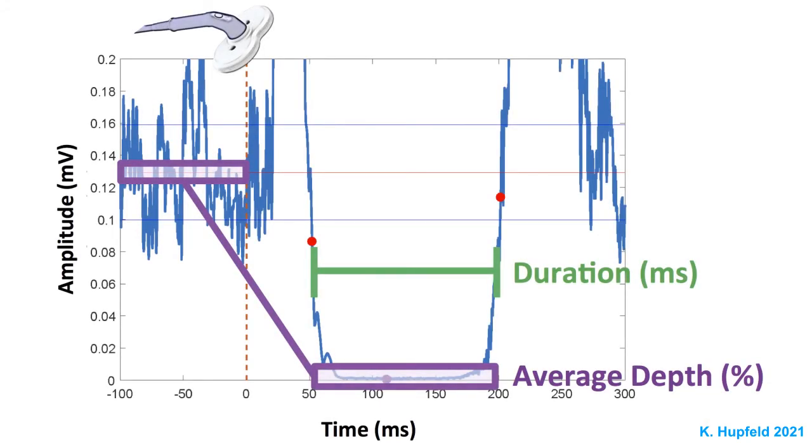To obtain a quantitative measure of this functional cortical inhibition within the motor system, typically, researchers quantify the duration and/or the depth of the cSP. And commonly, researchers will elicit many cSPs per muscle, like 15 to 20 or more, and then, for instance, calculate an average duration or depth over all of those trials.